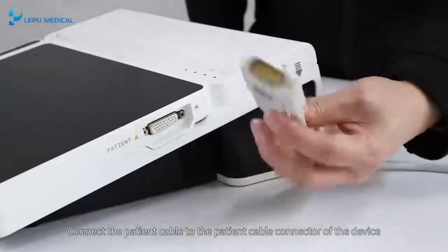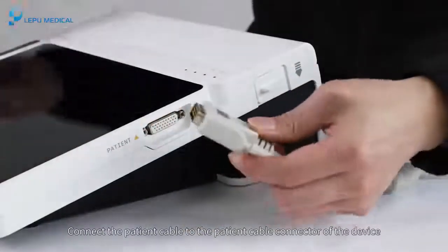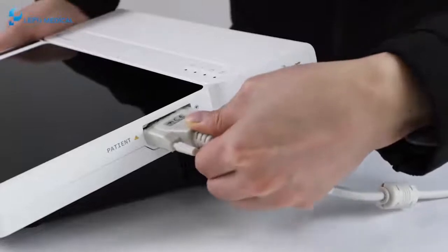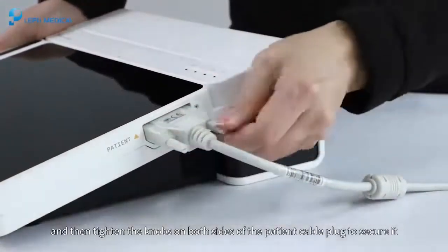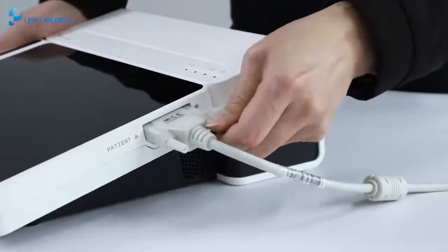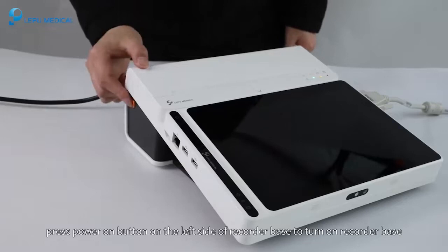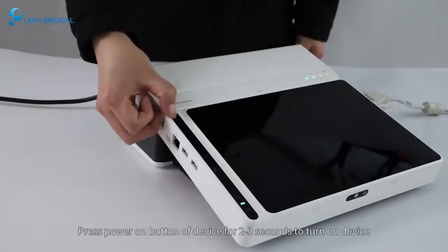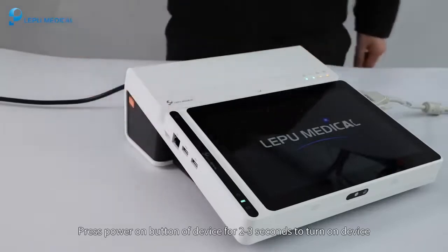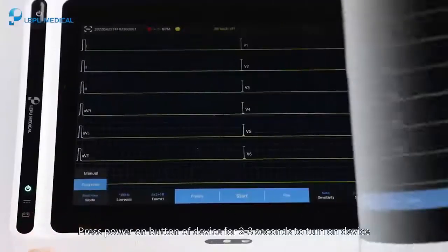Connect the patient cable to the patient cable connector of the device, and then tighten the knobs on both sides of the patient cable plug to secure it. Press the power on button on the left side of the recorder base to turn on the recorder base. Press the power on button of the device for 2 to 3 seconds to turn on the device.